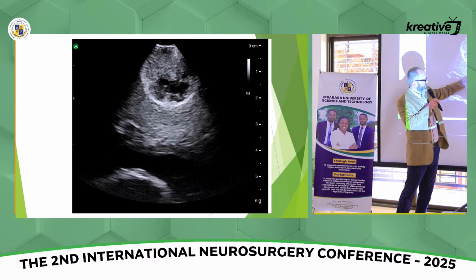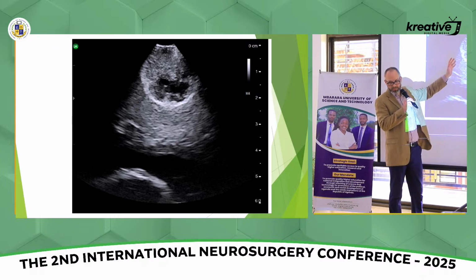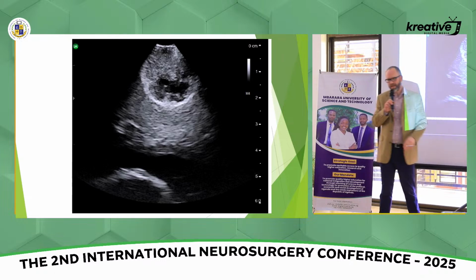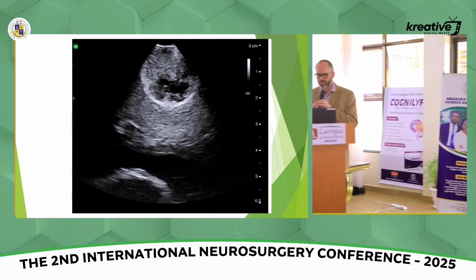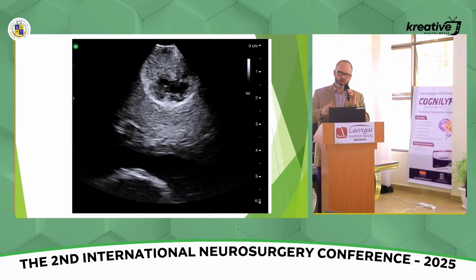The edema can be variable. Sometimes it's darker than normal white matter, sometimes it's brighter. Part of that depends on your machine and the imaging settings, so the literature is a little contradictory. I would say from my experience, it's more commonly brighter than normal white matter.